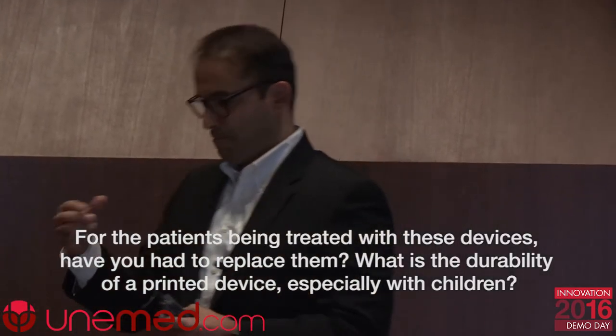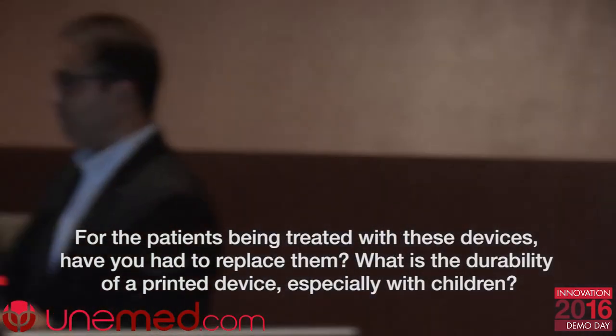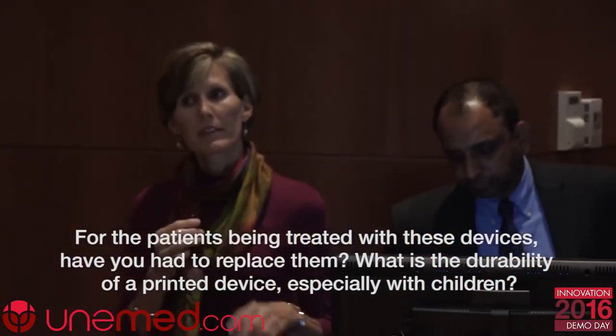Regarding whether patients need to replace devices over time — it really varies. Girls' devices last longer than boys'. The great part about 3D printing is that if they break a piece, we can just reprint that one piece and attach it — we don't need to remake the whole device. When kids grow and get bigger, we simply print a new device at very low cost. Our latest version is much more functional, and kids are getting a lot more use out of it.